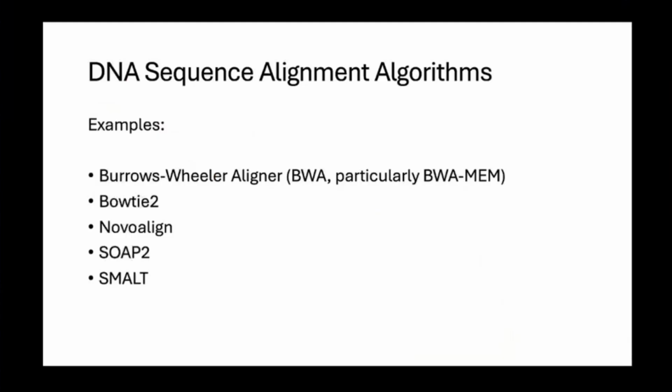There are many algorithms out there to align data to the reference genome. Ultimately, what you want is something that's fast, and it shouldn't be a big compute hog. But by far the most important thing you want is good quality alignments. Different aligners may be better or worse for certain types of assays. For example, we use NovoAlign for our small amplicon panel because it has nice features for automatically removing primer sequences from your data.